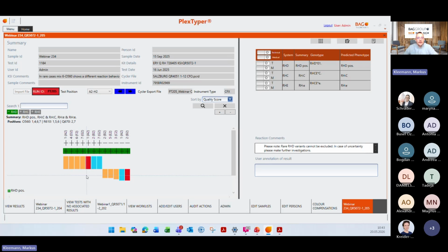And on this point, I will go more in detail what the quality score is, how you can work with this quality score in the advanced webinar, so not today. I think for today, the information will be enough that this is the reaction quality itself.